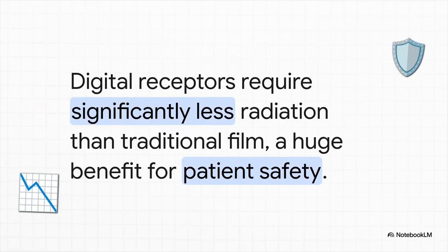And this is where modern tech is just wow. It's amazing. Today's digital receptors are incredibly sensitive. This means they not only give you an instant image on the computer screen, but they can require up to 80, even 90% less radiation than old school film. I mean, that is a massive, massive leap forward for patient safety.